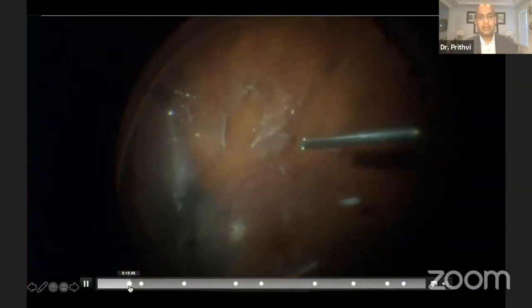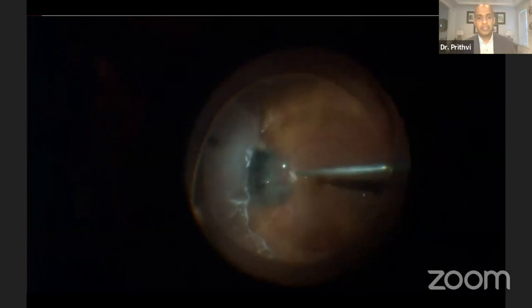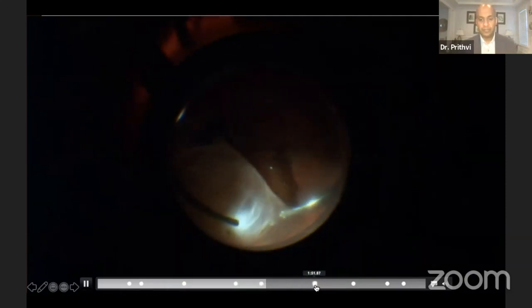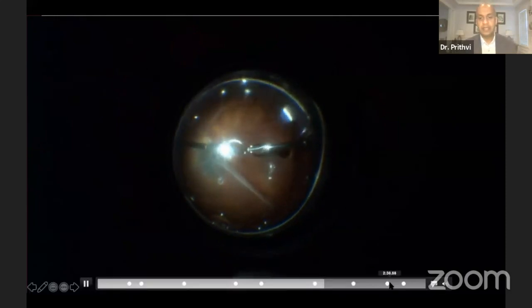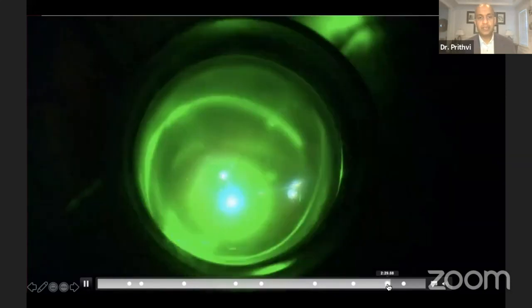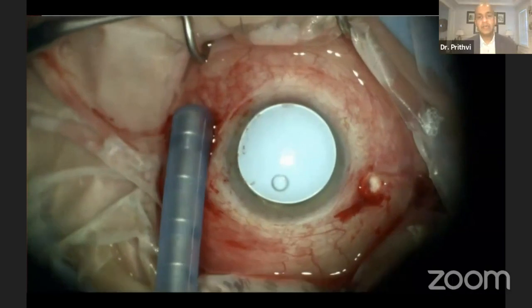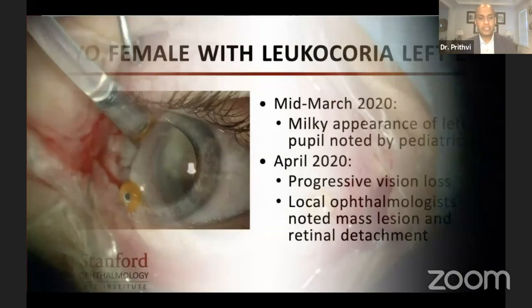So the patient underwent vitrectomy surgery. Here we can see the lifting of the hyaloid. We can see the placement of perfluorocarbon to stabilize the posterior pole, and dissection away with both forceps and bimanual technique with a lighted pick to clear the hyaloid into the periphery. Full peripheral shaving is performed, and a candidate break is identified, and the retina is then repaired and endolaser placed around the tumor and the break. I always suture these sclerotomies, and I always place cryotherapy at the sites for protection.